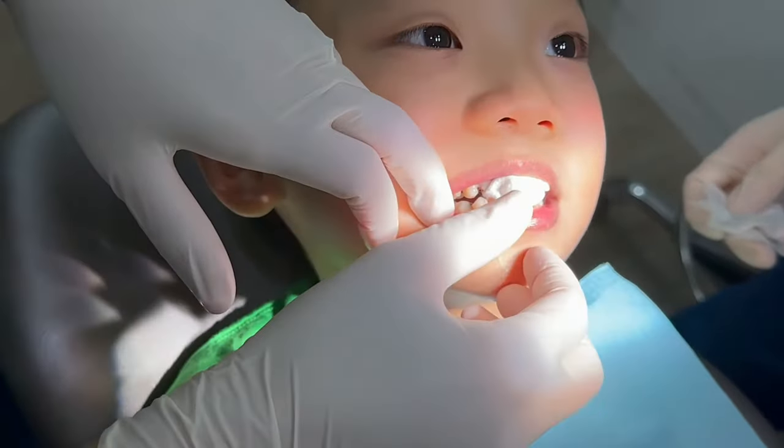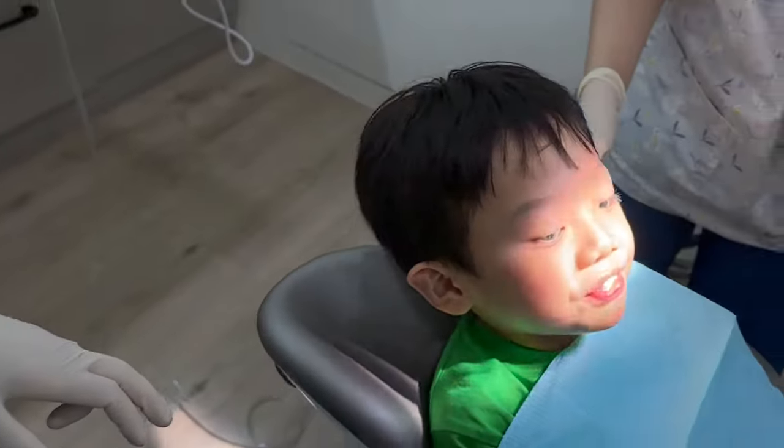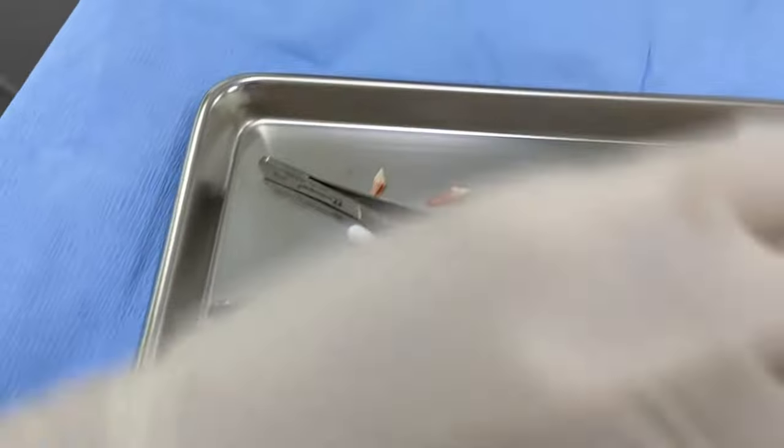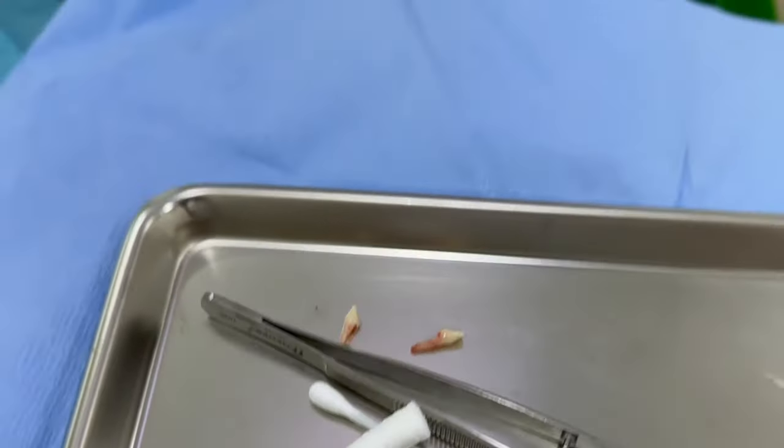Okay, bye together. Hold there, okay? Good job! Good job! Wow. See, where's your teeth? Oh my gosh, that was so fast!